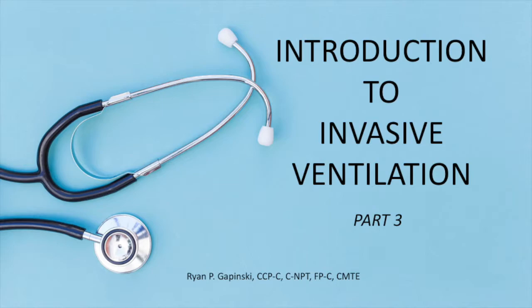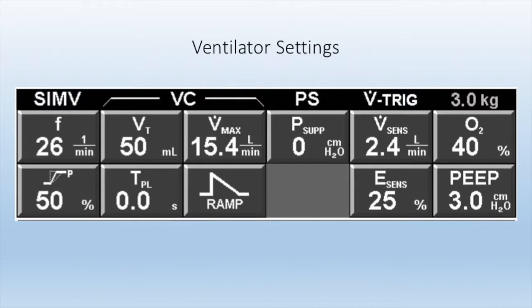Today we'll be concluding our Intro to Invasive Ventilation series. We're going to be focusing on the use of ABGs to optimize mechanical ventilation. Now, depending on the model of ventilator that you're using, you will see a screen that looks pretty similar to this, or at least you should be able to find these parameters somewhere on it. The settings we're going to be focusing on today are frequency or rate, tidal volume, oxygen percentage or FiO2, and PEEP. I'll go into the other parameters in a future session.